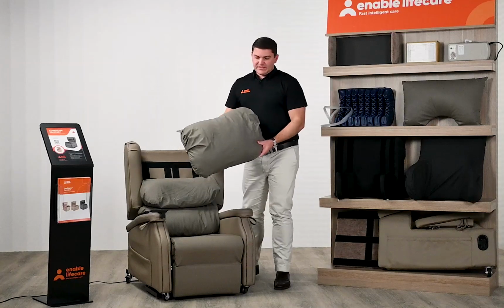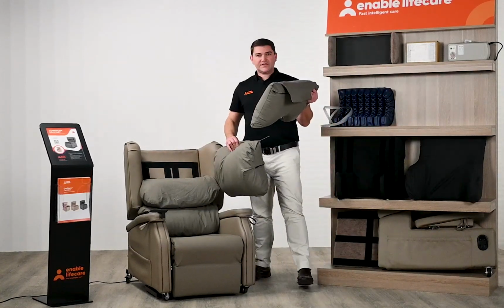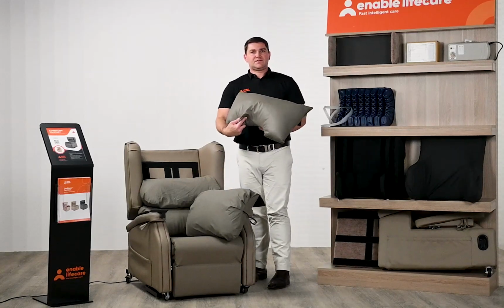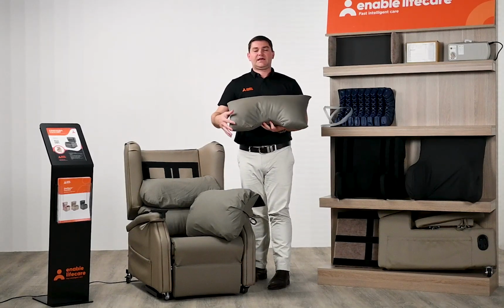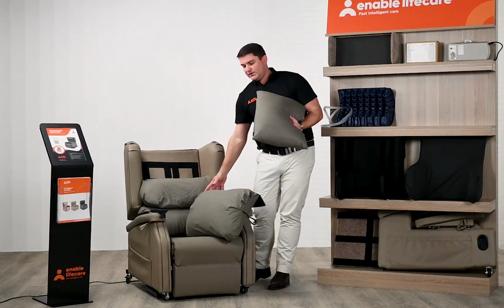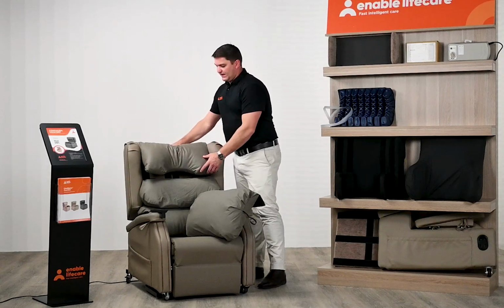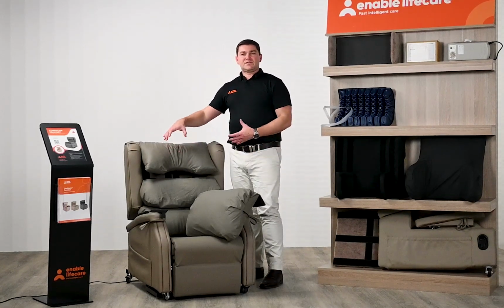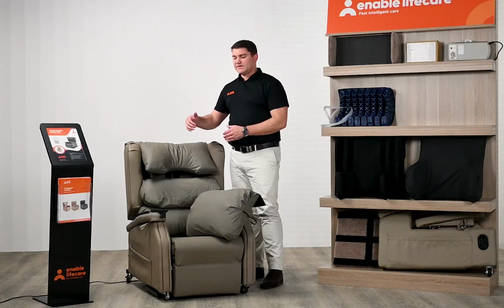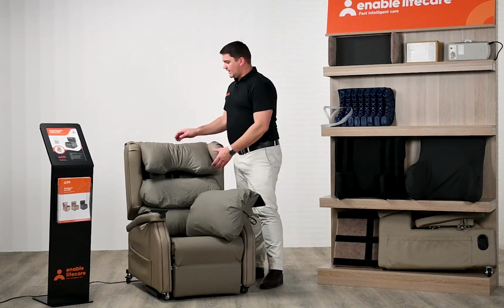In addition to the standard pillows, we do have the Profiled Headrest. So as you can see, this has got the cutout in it to provide that head support. And so what we can do is remove the existing headrest pillow and we can position this in place. And what that allows us to do is give that good head support and help the rest of the body to stay nice and upright.